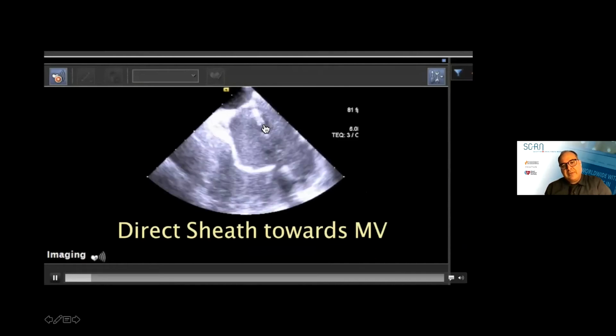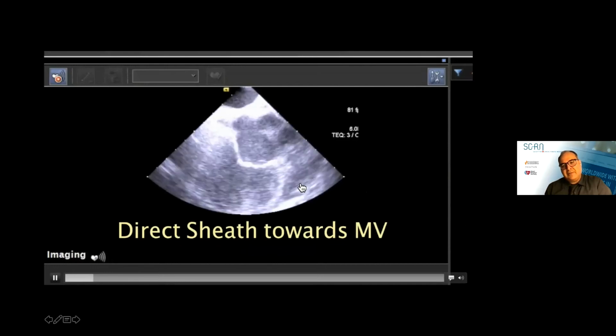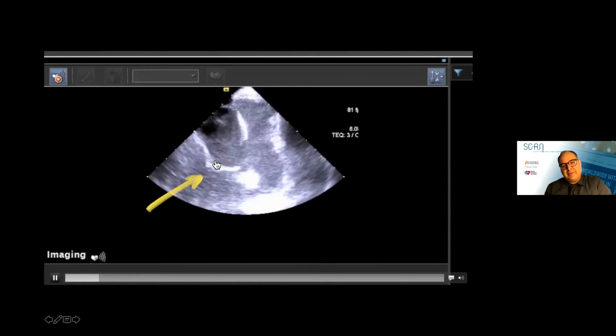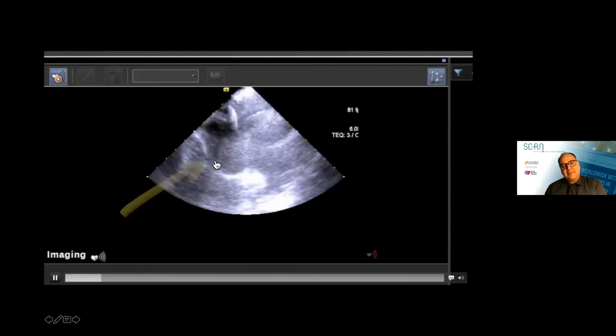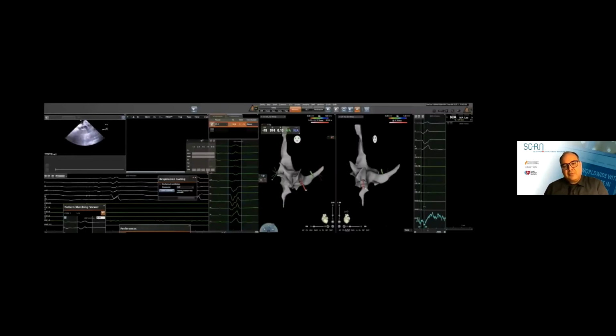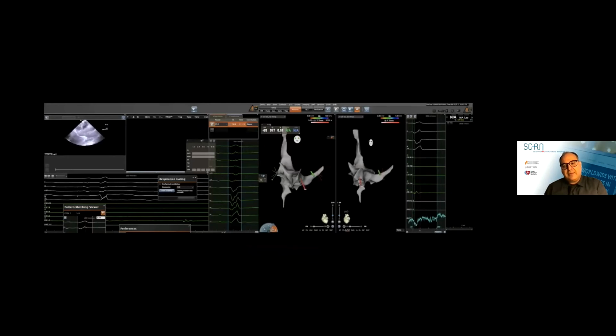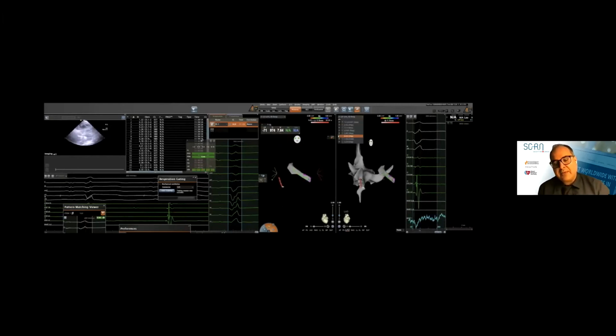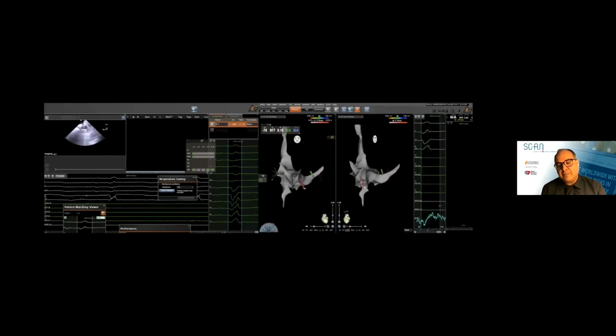If you don't look at this and just push the catheter in, you can easily go and perforate the appendage. But you can see very well the catheter. So we bend the catheter down towards the mitral annulus and then push whatever diagnostic catheter you want to use through that without any danger of perforating any structure in the right atrium. In this case, I'm using a decapolar catheter. It's the same DecaNav that I mapped the right atrium with. You don't have to. You can use the RMT catheter or you can use the PentaRay. Sometimes I use PentaRay.